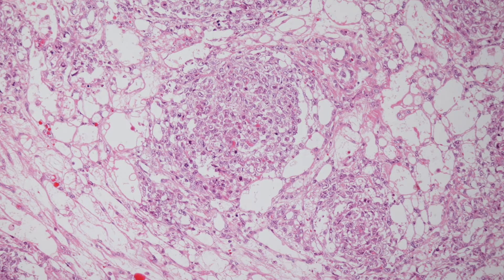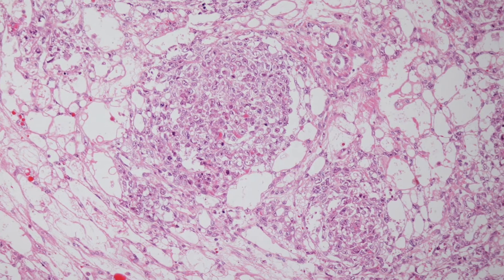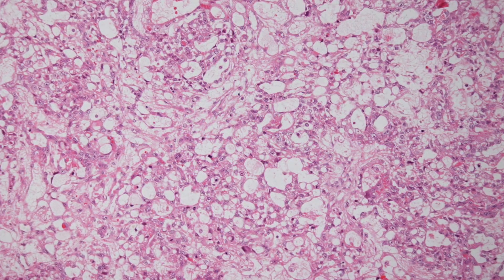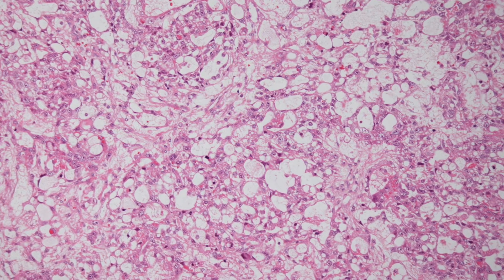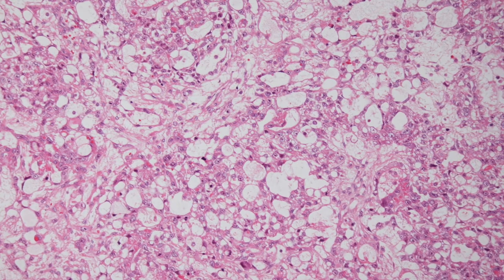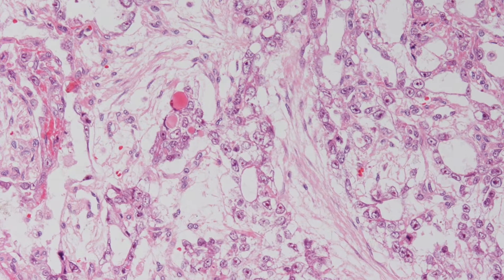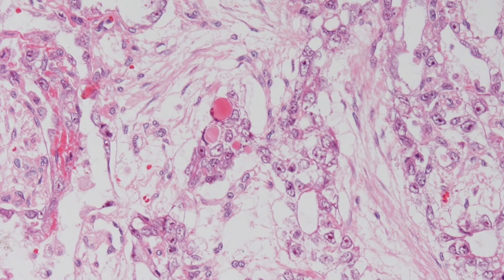This is a higher power view. Note the architecture of the cells and the various patterns present. Here you can take a closer look. This is the highest magnification. A clue is the globular material in some of the cells. What do you think it is?